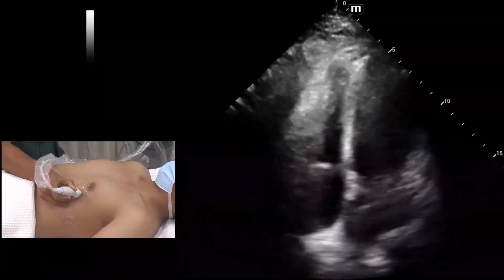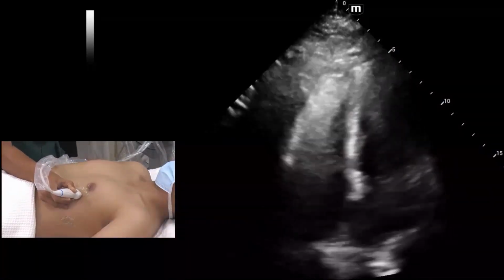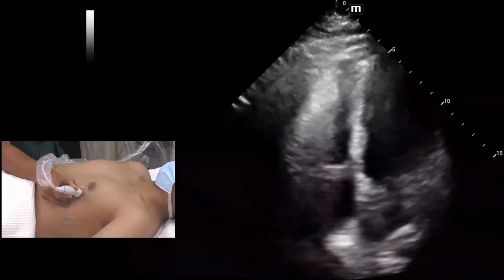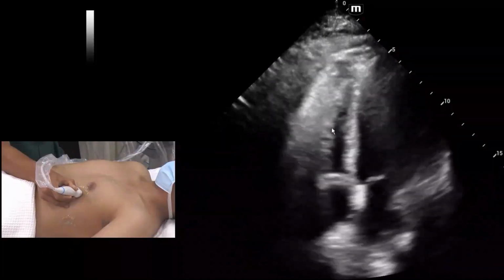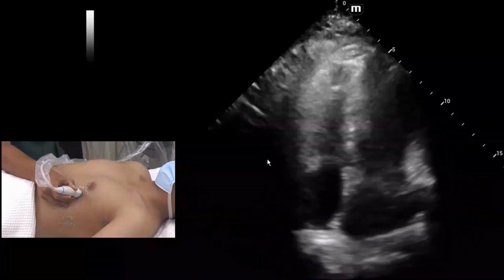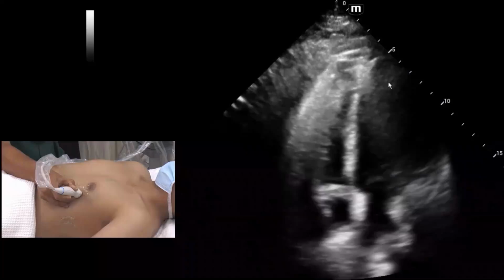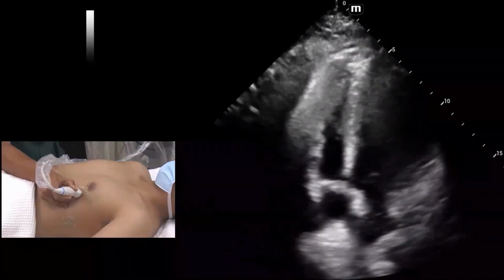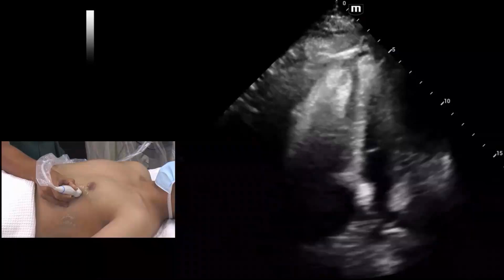What we're trying to determine is whether there is a sign of chamber dilatation. There are a few ways to do it. Number one is to look at shape. Normally the left looks like a cone, and the right is triangular. Any change of this shape can suggest a possible chamber dilatation.